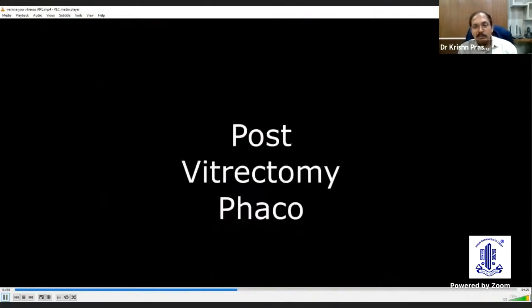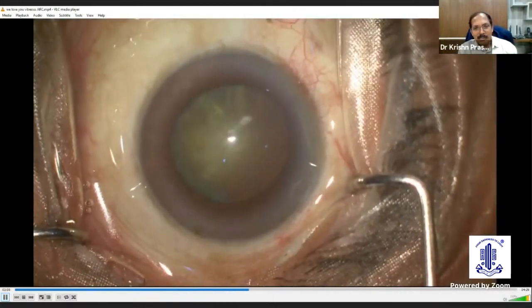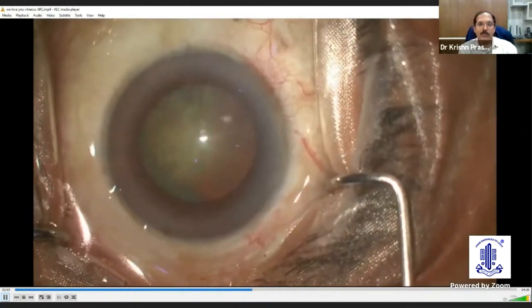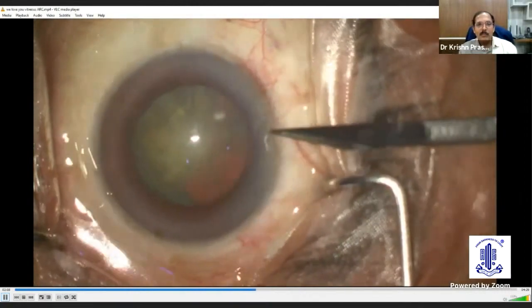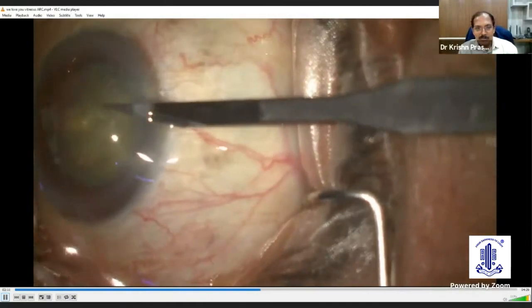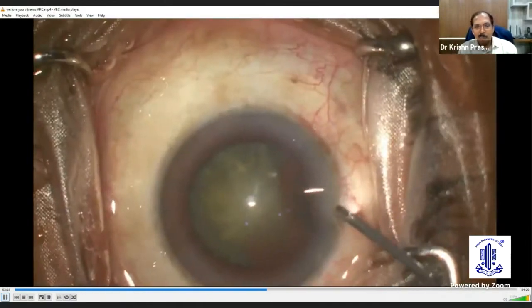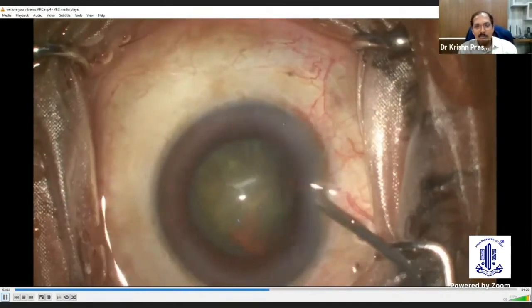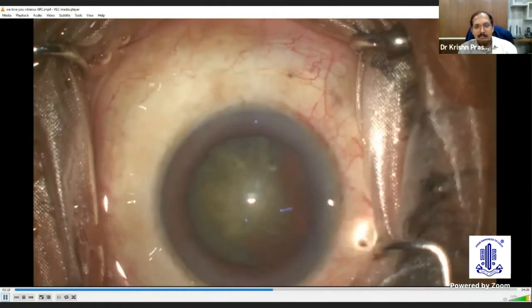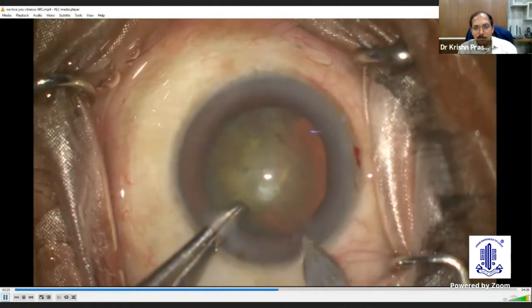But what if there is no vitreous at all? This is a situation where a posterior capsule defect has already happened. You can see a candlelight reflex in the posterior segment. He suspects a problem, which is why he is approaching the surgery carefully — with all the preparation in mind, he goes in and starts surgery on what appears to be a post-vitrectomized eye.